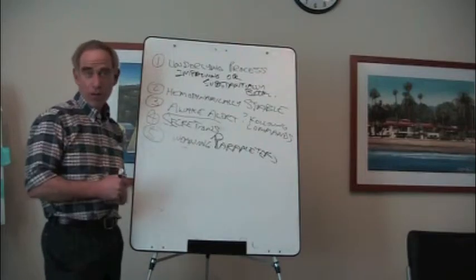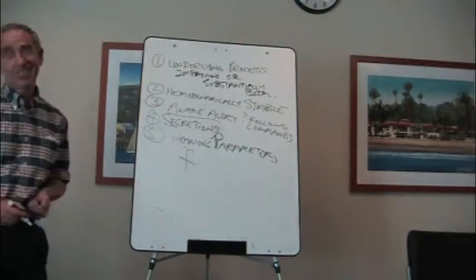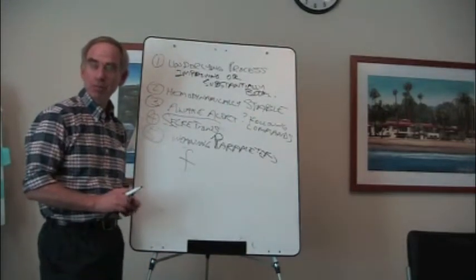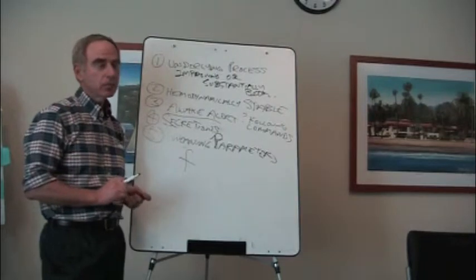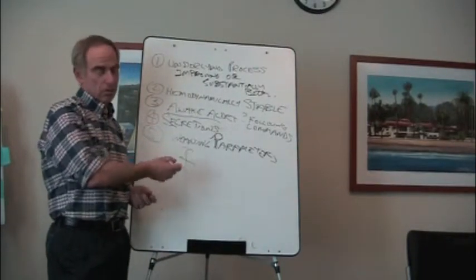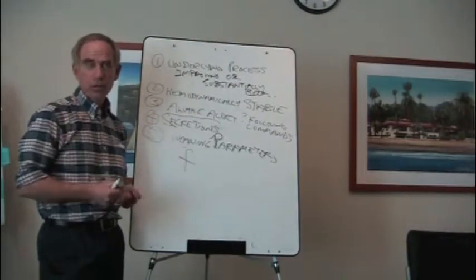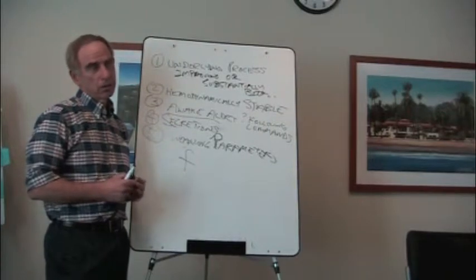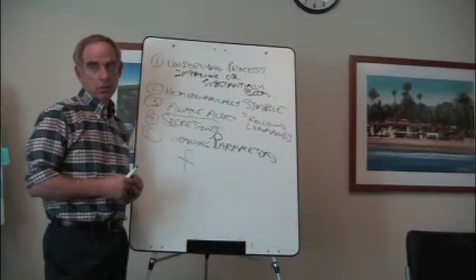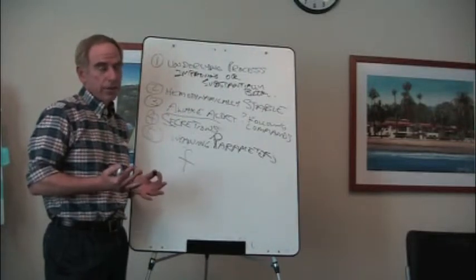Actually, there was one more parameter which I forgot about, and it was frequency. Just rate, respiratory rate. I knew there was a sixth one. Can't believe I forgot it. So, I guess let's do the tidal volume, and then we'll come back to frequency. Question: what does it tell you about your patient?